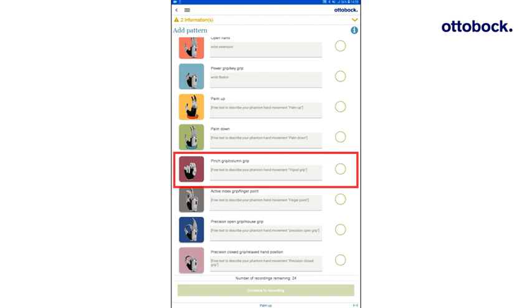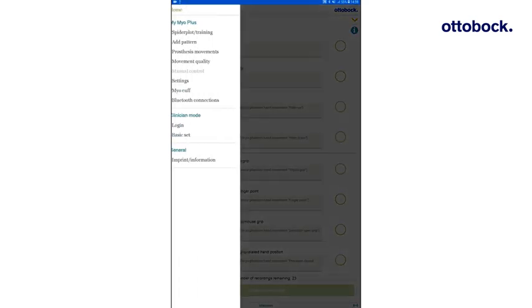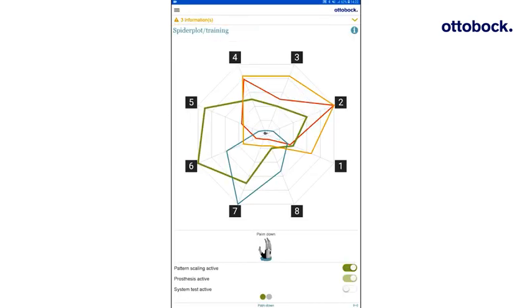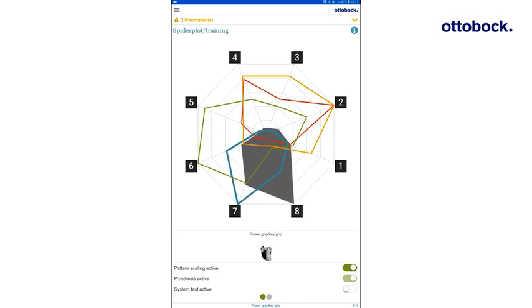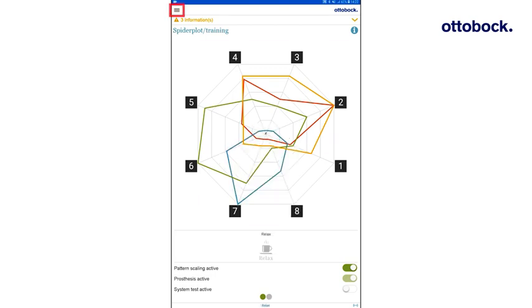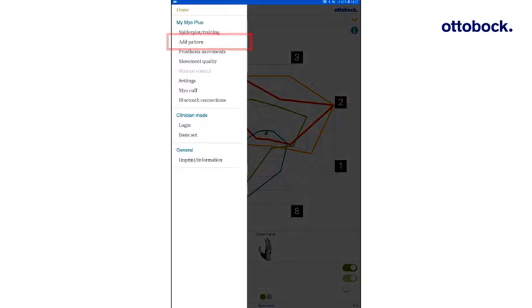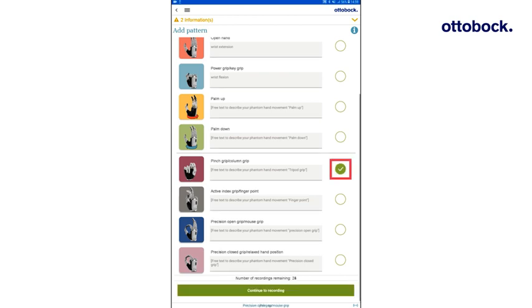Before recording, a new separable movement pattern must be identified for this grip. Therefore, navigate to the Spider Plot and evaluate a new movement pattern which is different from the already recorded colored movement patterns. If this separable movement pattern is found, navigate to the Add Pattern screen, select the checkbox next to the respective movement and tap Continue to Recording.